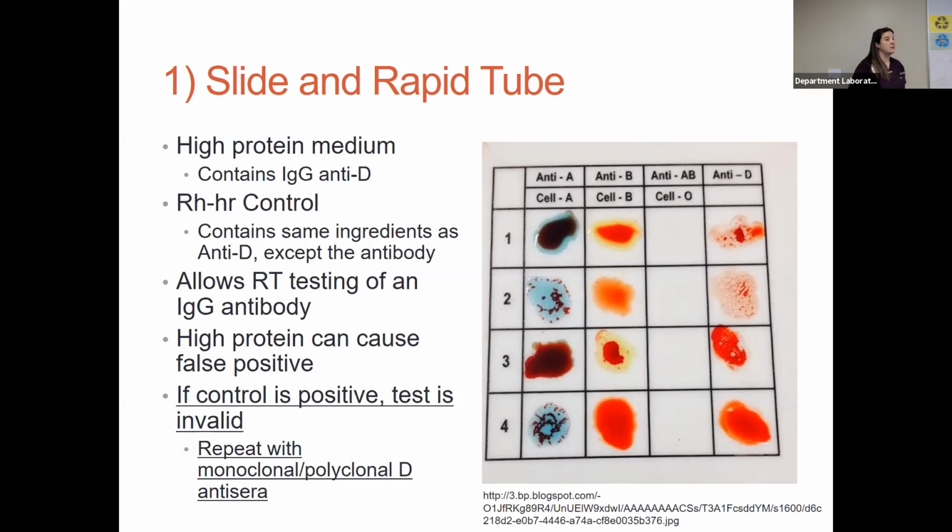Okay, so when that comes to play a very important role, think about if you have an AB positive patient. What's your front type going to look like? Positive with everything. Anti-A is going to be positive, anti-B is going to be positive, A comma B is going to be positive, D is going to be positive. How do we know that that's not due to some type of polyagglutination, something attached to the patient cells causing those positive reactions in all of those tubes? The reverse is negative, but that's using patient plasma. Yes, but you want to make sure that our reagents are not causing all of those reactions. So we can use what we call a Rh control. That gives us a negative reaction in the front type, letting us know that our patient's reactions are true and not due to polyagglutination.